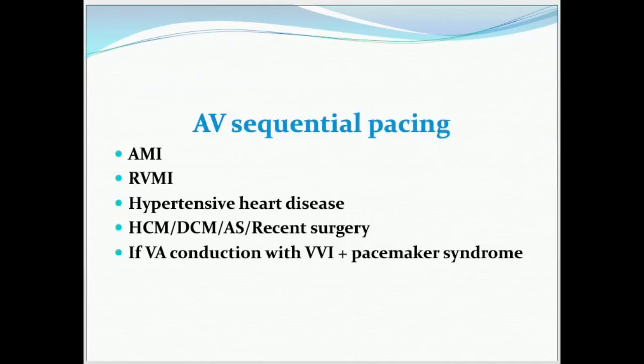Dual chamber pacing is effective in case of anterior MI, right ventricular myocardial infarction, hypertensive heart disease, hypertrophic cardiomyopathy, dilated cardiomyopathy, aortic stenosis, recent surgery, or if VA conduction with the VVI plus pacemaker syndrome.